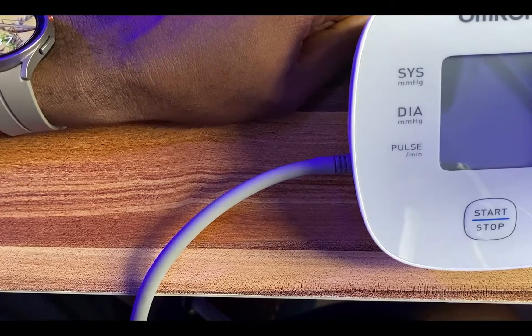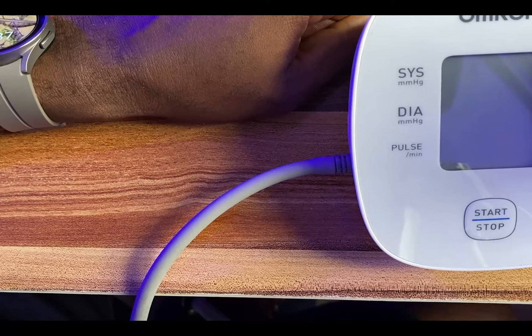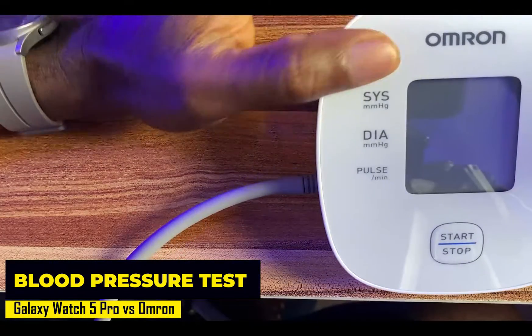Hello everyone, it's Judy and welcome to Smartwatch Stories. In today's video, I'm going to be comparing the blood pressure measurement feature of the Galaxy Watch 5 Pro against the Omron blood pressure monitor.